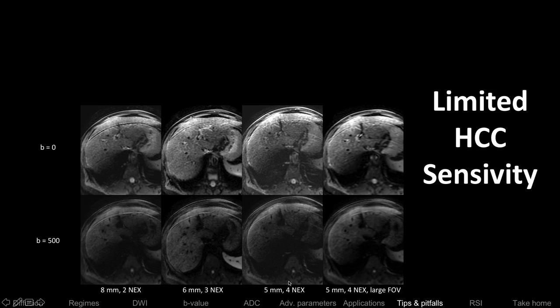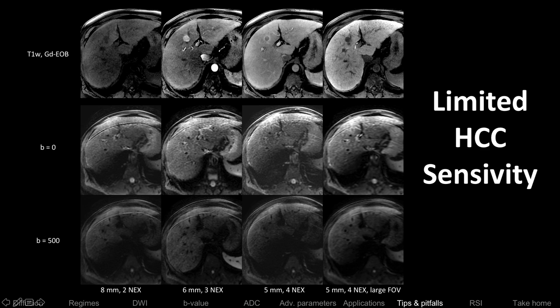DWI is not that good for HCC. I've shown cases where it helps, but HCC can be very tough to detect on diffusion. Here's a DWI at B0 and B500: I really tried hard — 8mm, 2-NEX, 6mm, 3-NEX, 5mm, 4-NEX, large field of view — and could not find this patient's cancer on DWI. But here it is with gadolinium: washout, capsule, hypointensity on hepatobiliary phase. The teaching point is that HCCs are often invisible on DWI.